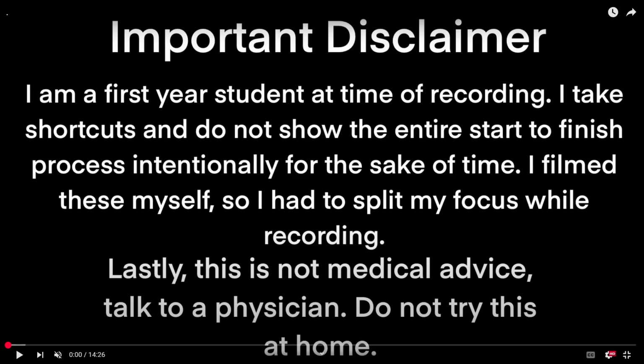Now, I want to go ahead and get this disclaimer out early. I am a first-year CAA student at the time of this recording. I do take shortcuts, and I do not show the entire start-to-finish process intentionally for the sake of time. I filmed these myself, so I had to split my focus while recording. I have to have a path for the camera to record, so I have to get out of the way of it, which means my form is going to be awkward in some of these shots. I may or may not point it out as we go.